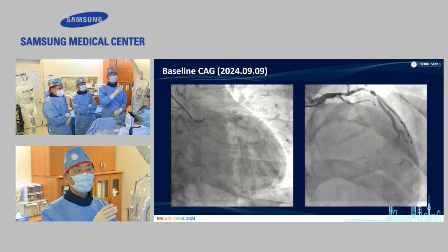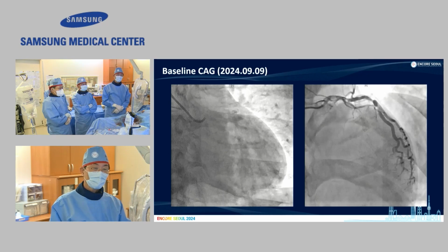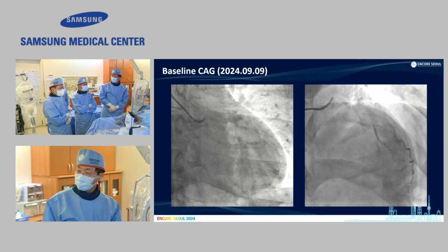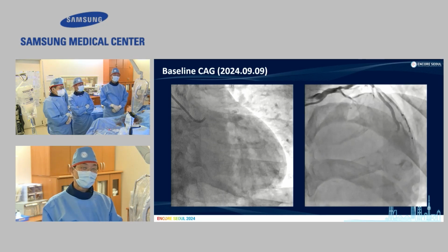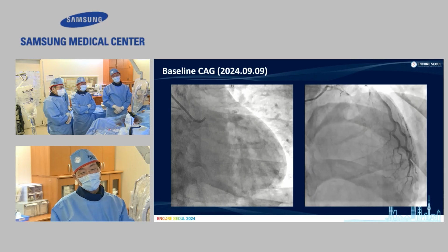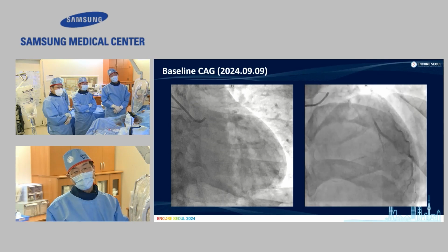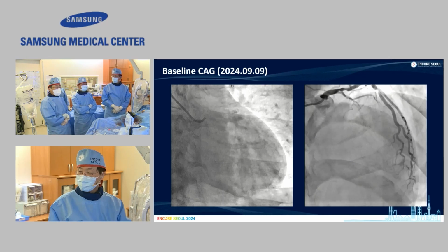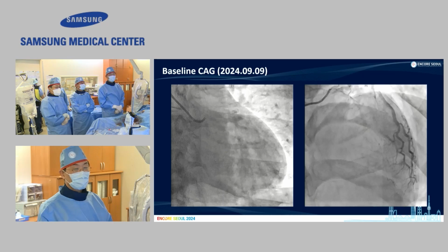Of course, the LAD is of most clinical significance, so there is no pressure to have success in the diagonal, but the diagonal artery is actually big, and it is the only one big diagonal artery. So I'll be happy to wire it.